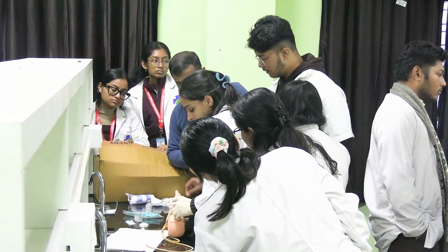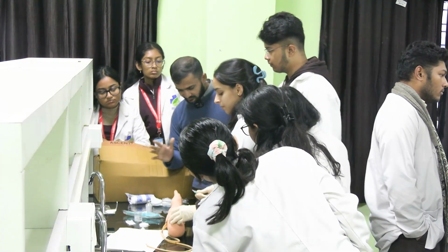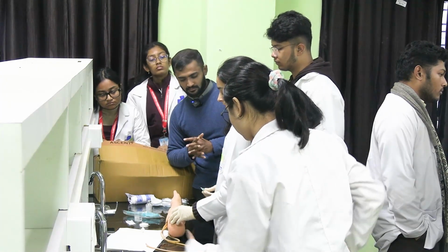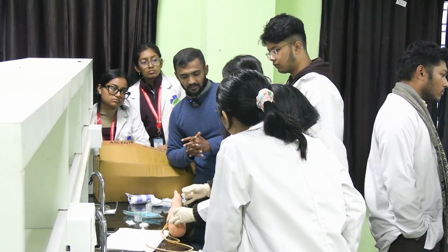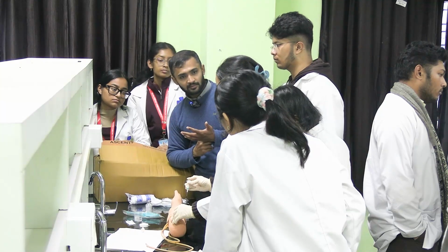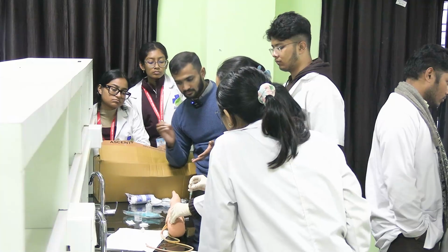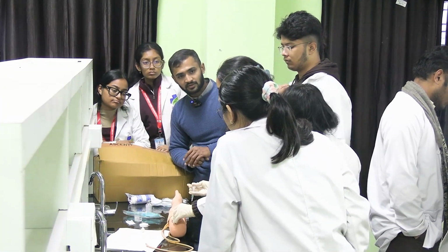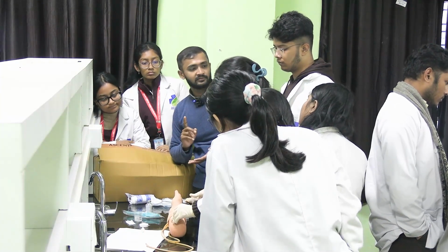So when we are sterilizing the area, do we do it before wearing gloves or after? After, because all these things are already sterilized, and you have also sterilized yourself. I have a doubt: how will we know how much needle we have to insert? There is no such thing. You just do the procedure, and the angle and the site will determine it. This is a blind procedure. We are not going with a camera. Whether it goes to the muscle or to the subcutaneous tissue, the site, the needle and the angle will determine it.